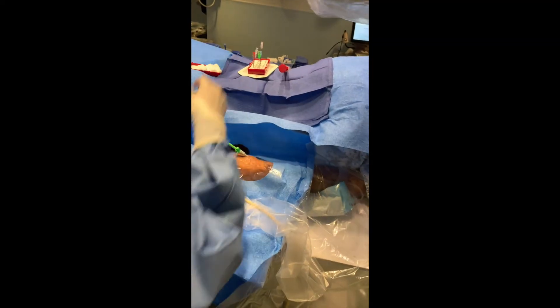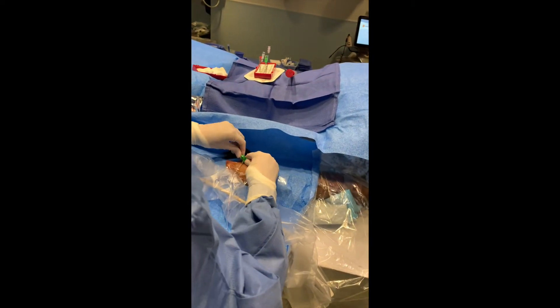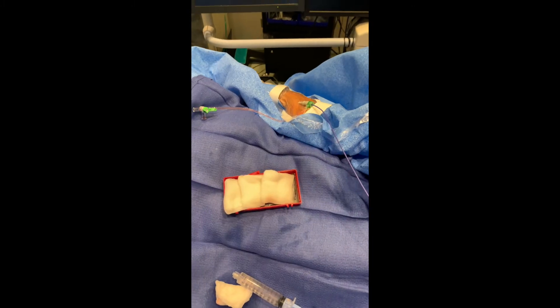The sheath is inserted very smoothly and we're ready to begin.